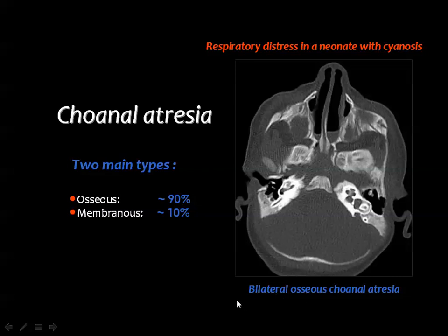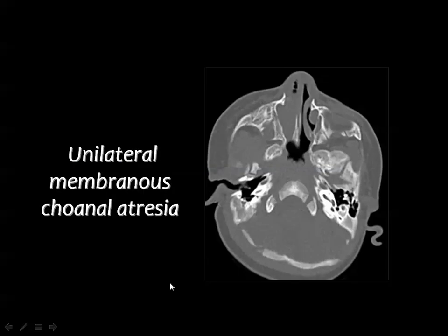We have two main types of atresia: the osseous type, which is very common compared to the membranous type. In axial CT images, we look at the posterior choana, and you can see a bony ridge obstructing the posterior nares bilaterally, along with accumulation of secretions proximal to the site of atresia.